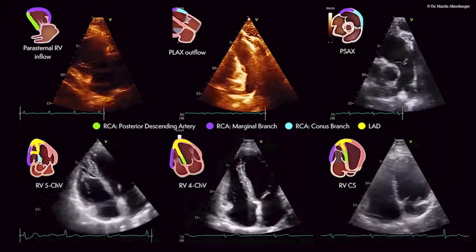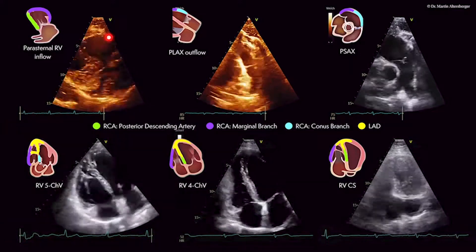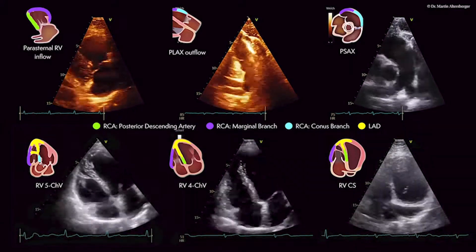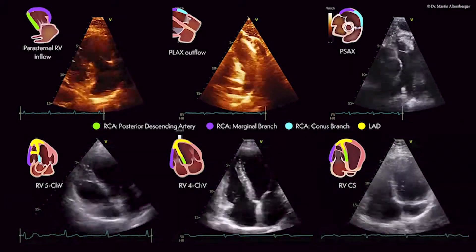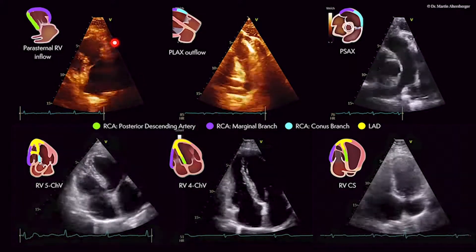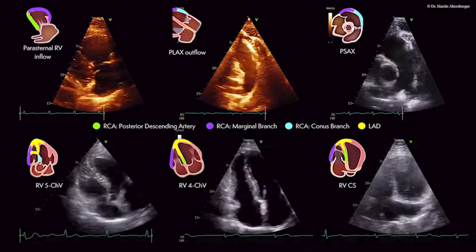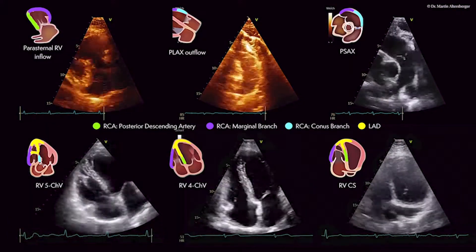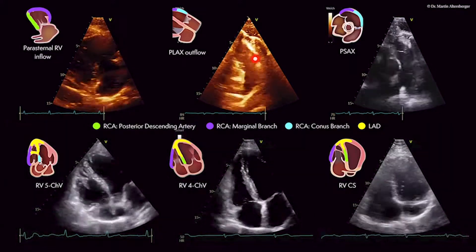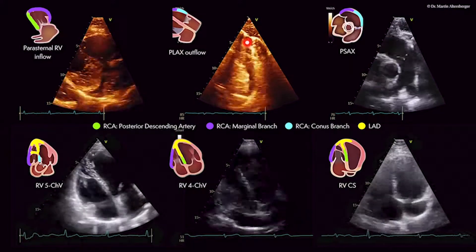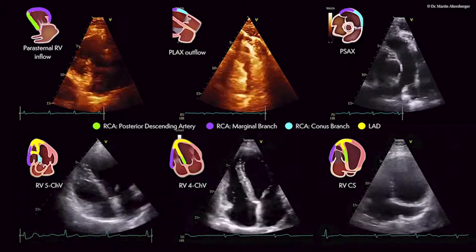In the parasternal right ventricular inflow view, we have here the anterior and the posterior wall. The right coronary artery marginal branch is responsible for supplying the anterior wall seen here. The right coronary artery posterior descending artery is responsible for the posterior wall. In case of the infundibulum or the RVOT seen here, we have the RCA conus branch, and we can also see this in the parasternal short axis view.